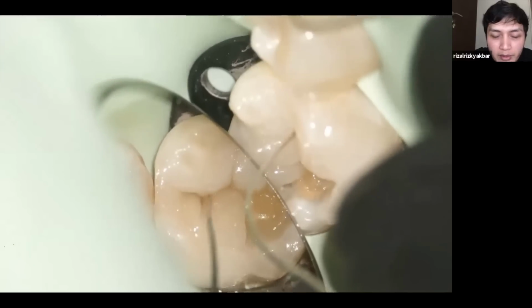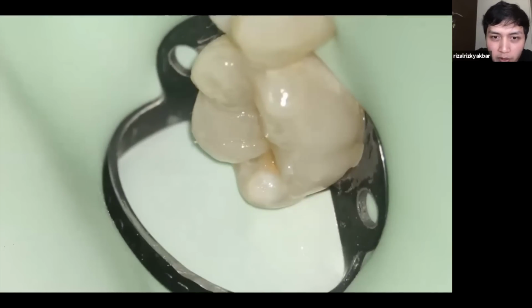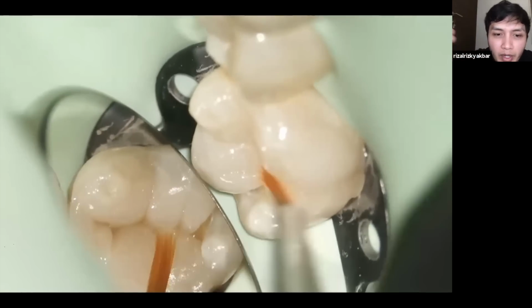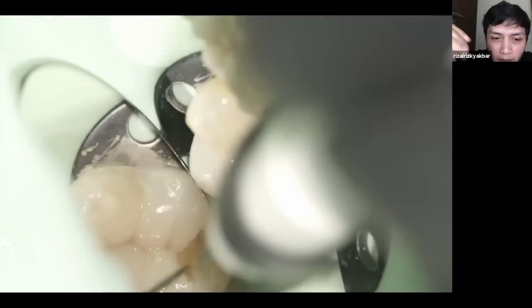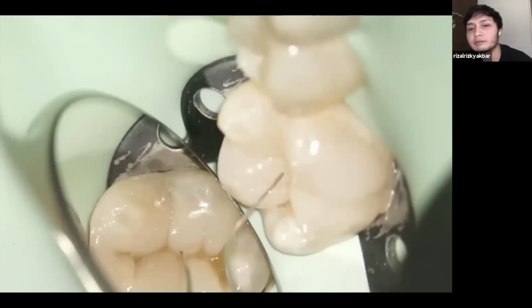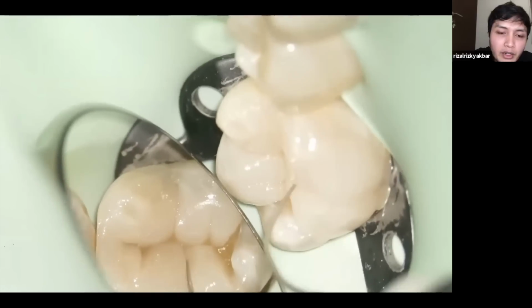So remember what I said, composite carving is only about creating a space with your instrument, and then after that you make it close to each cusp by touching it with your brush and then cure, just like that. That's why I need a very sharp instrument.